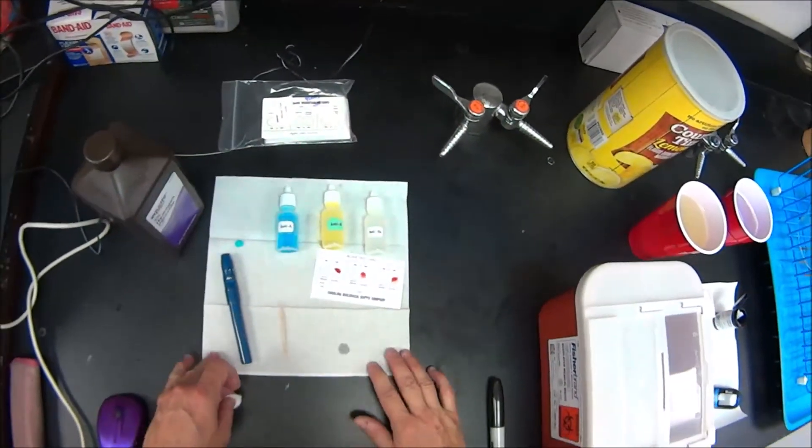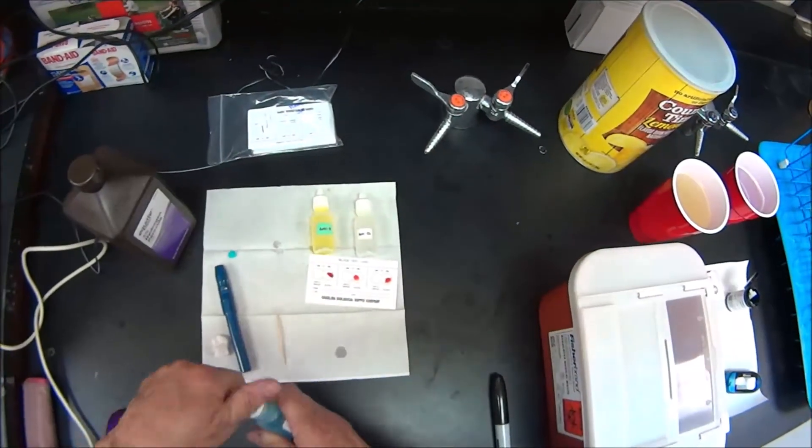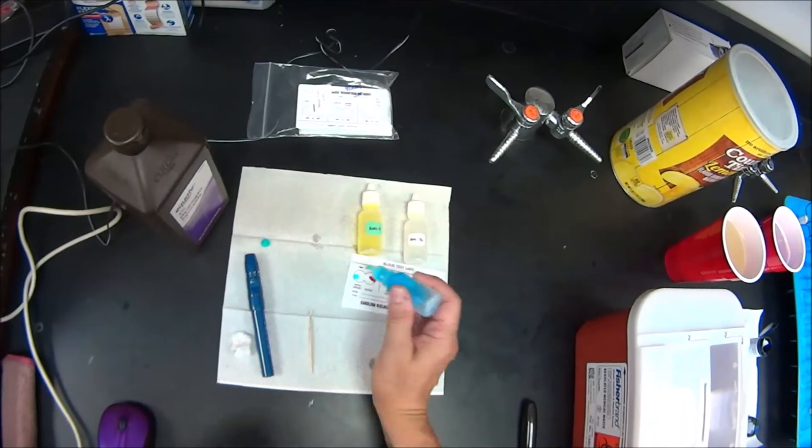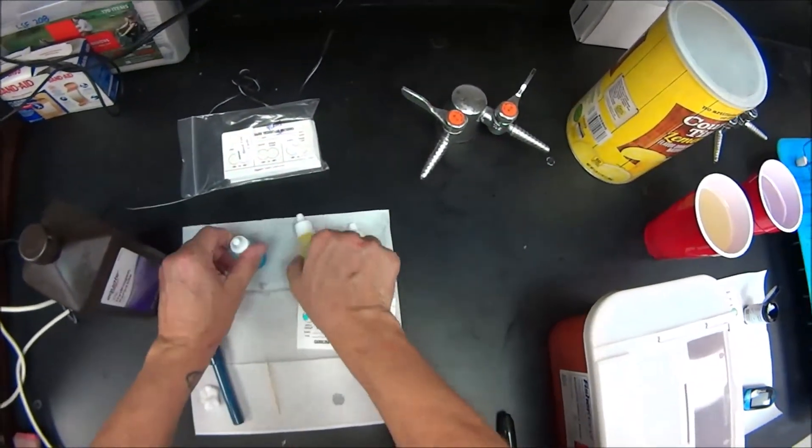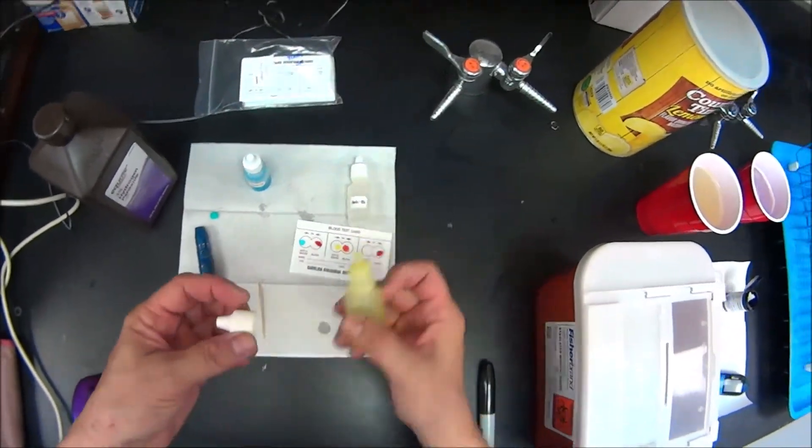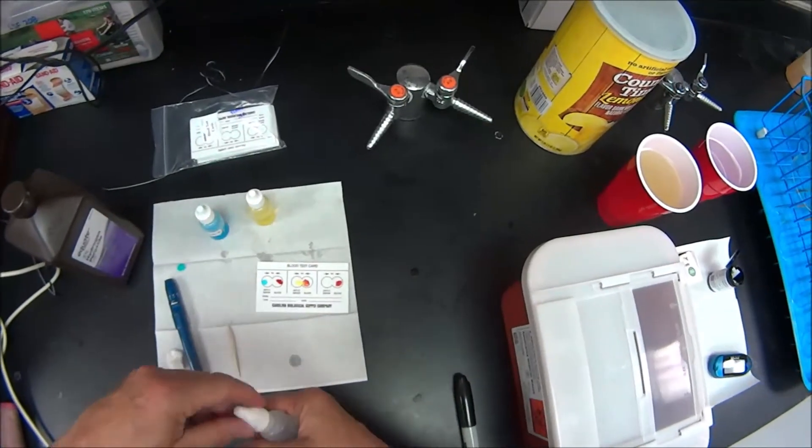Now, before anything dries on that card, I'm going to add the antibodies. So here's anti-A. Alright. Here is anti-B. The suspense is killing you, isn't it? Alright. And the anti-Rh is here. Okay, we are ready to go.